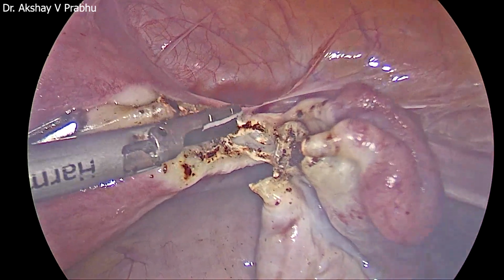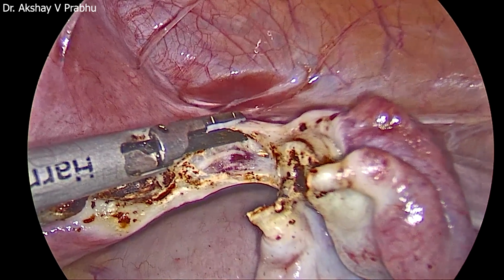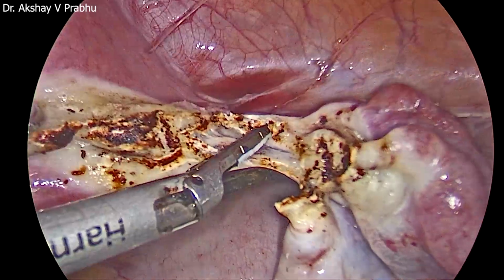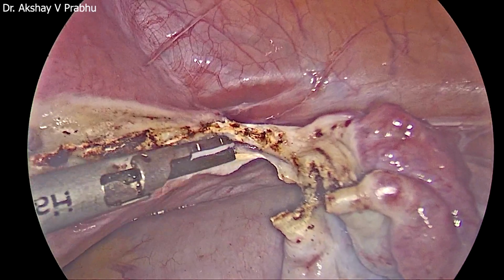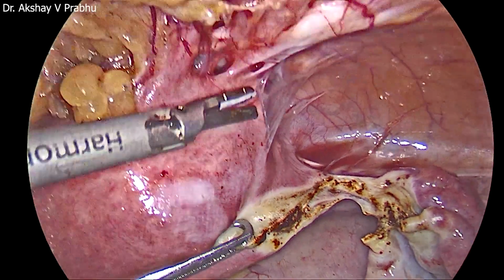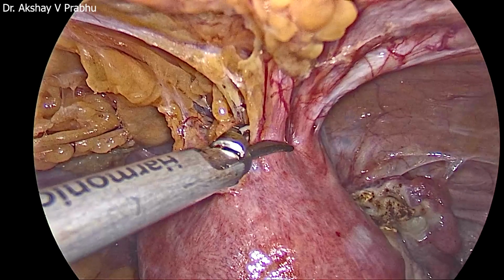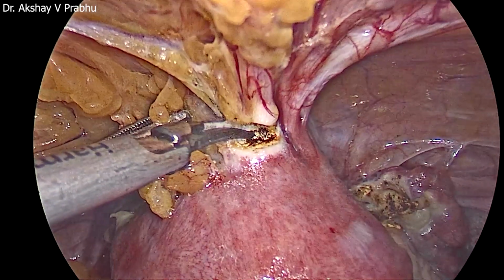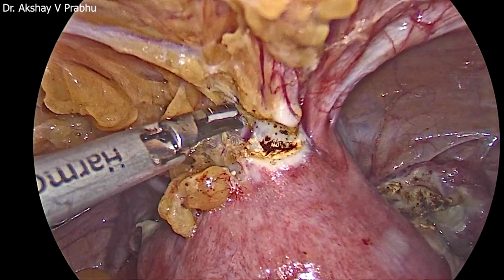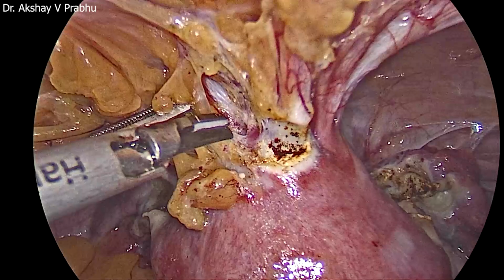So slowly I've taken all the cornual structures on the right side. The broad ligament has been opened. You can see the excessive vascularity there, pulsations happening there. So the right side cornual vascularity has been completely taken. Now I've put the uterus on stretch. There's a vaginal manipulator, the common one we use, the sound with speculum. I've retroverted the uterus and put it on stretch, and I'm just trying to tackle the adhesions.